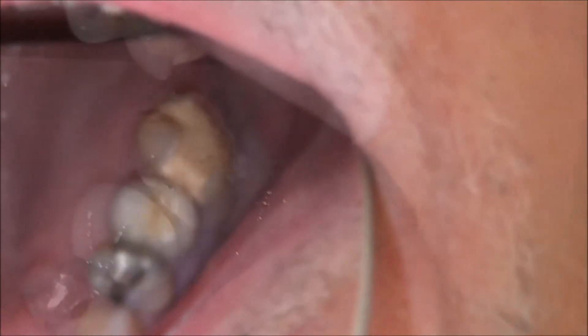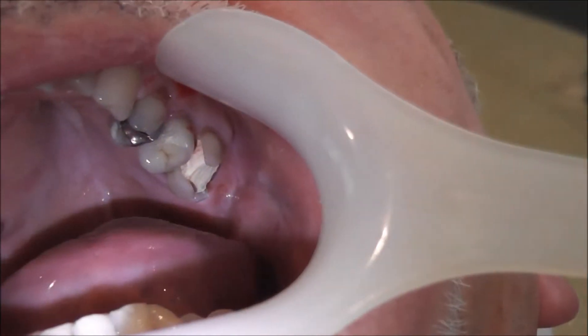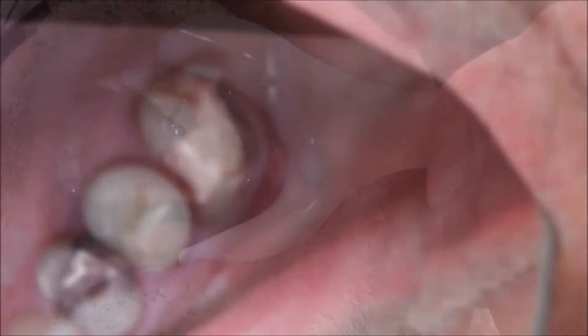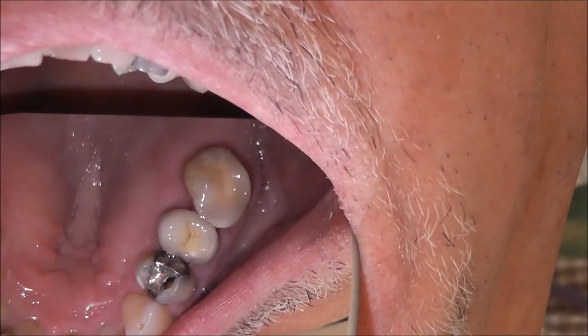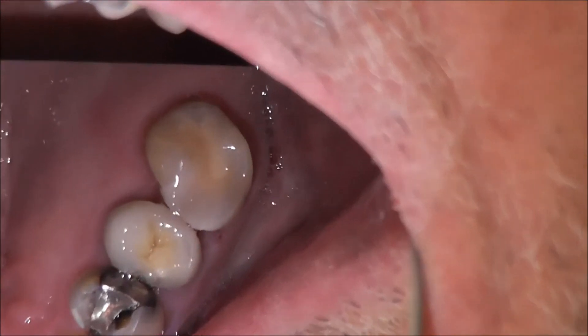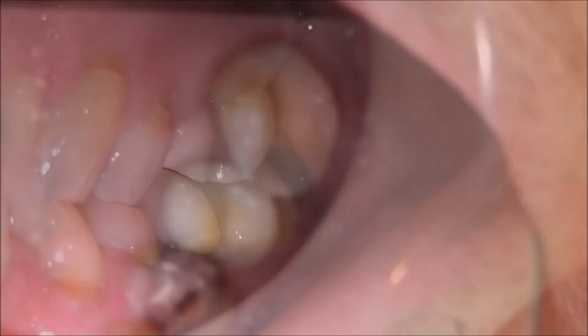However, a small amount of chipping has occurred on the palatal and mesial aspects. The cavity and the biodentine are then prepared for a direct composite, clearing the margins for good bonding. The direct composite restoration is then completed and polished, and as you can see from this angle the biodentine is visible through the translucent composite, giving a nice natural cosmetic result.